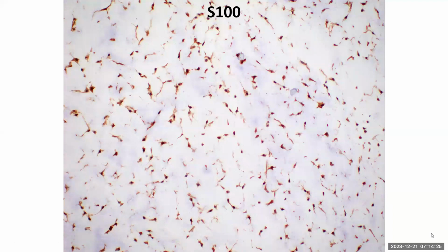So S100 is a good marker for chondrocytes and chondrosarcoma. As you can see here, it labels both the nuclei and the cytoplasm of these individual tumor cells unequivocally, and so that supports the chondroid differentiation.